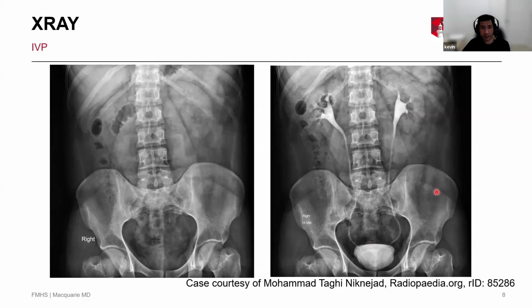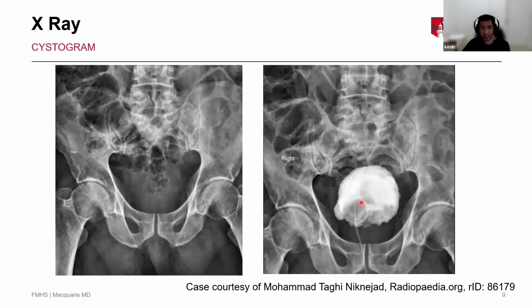The other thing I mentioned was, if you have a catheter in, you can inject contrast into the catheter and it fills up the bladder. The reason why you don't see it going up the ureters is because the ureters, as they enter the bladder, go through a longer tissue tract and it acts like a valve, so you should not get reflux. Okay, so this is one other way of imaging the inside of the collecting systems. All right, so this is the general theme.